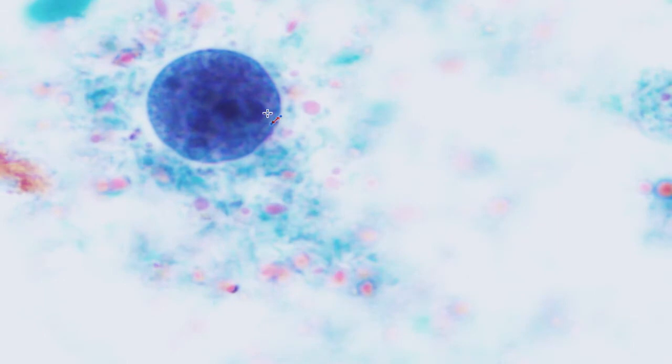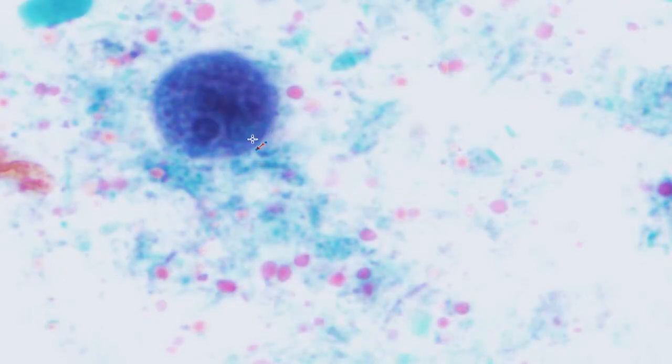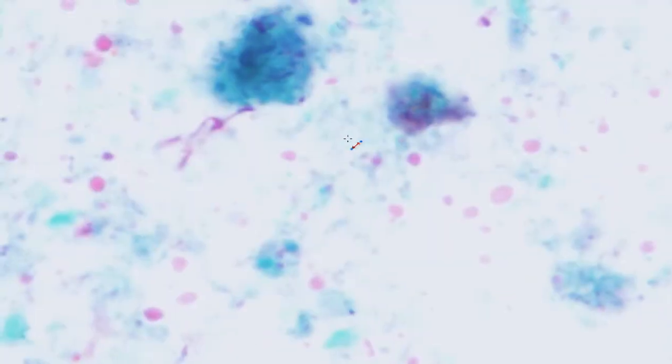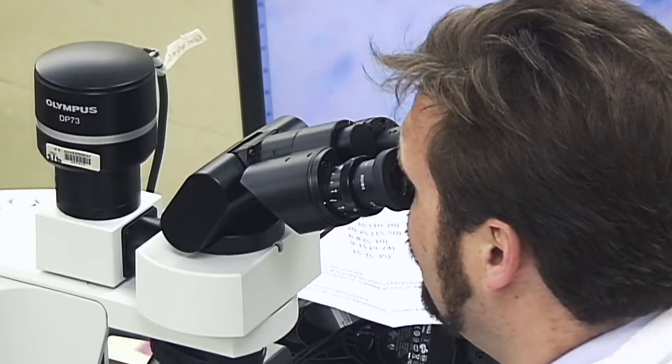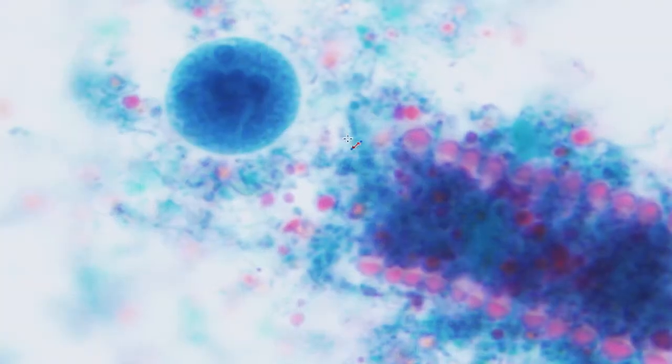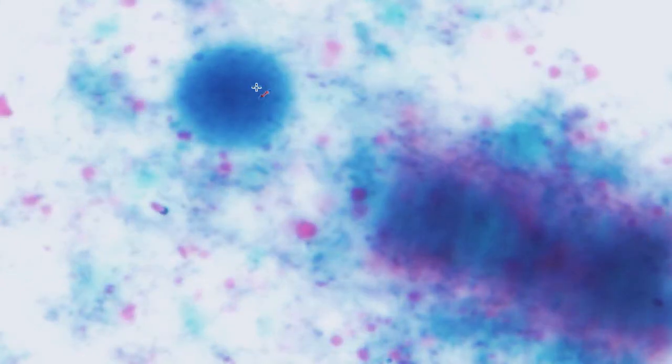Uneven peripheral chromatin to one side, relatively central karyosome. And as we move through, we'll just see if we can see any other nuclei easily there. So note that you do really have to have a look at all of the nuclei, all of the cysts. You can't just rely on, I've seen one nucleus and it's got a central karyosome, therefore that is Entamoeba histolytica. You really have to look at all the nuclei, get a picture of everything in the stool specimen before you make your final decision.